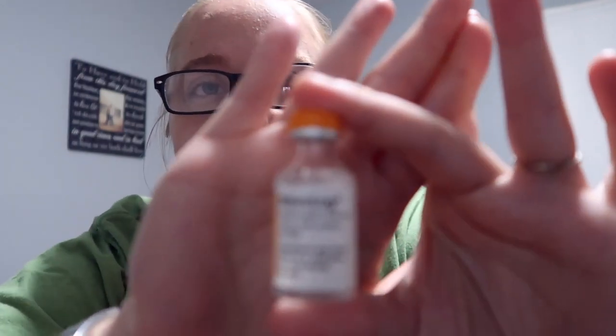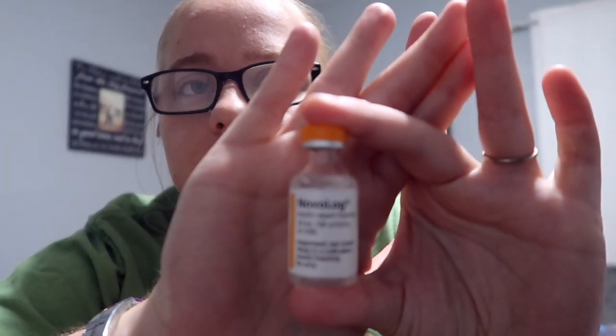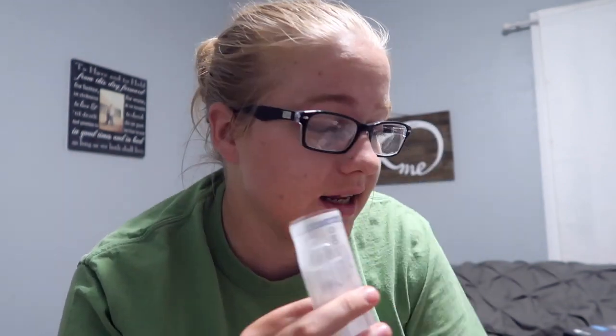The insulin that I will be on is Novolog. When you go to change it out, you will take your syringe and your insulin and put it into your new cartridge into your pump.